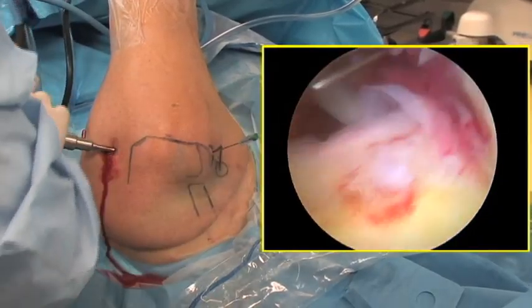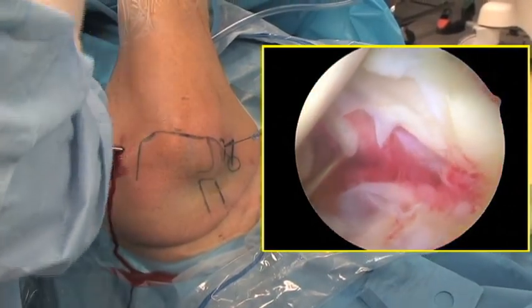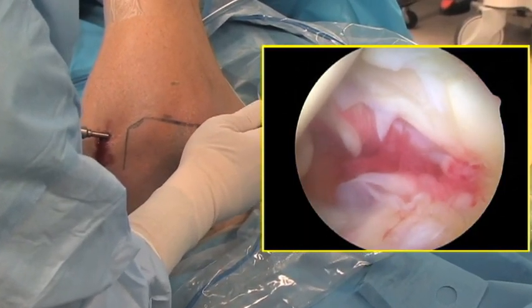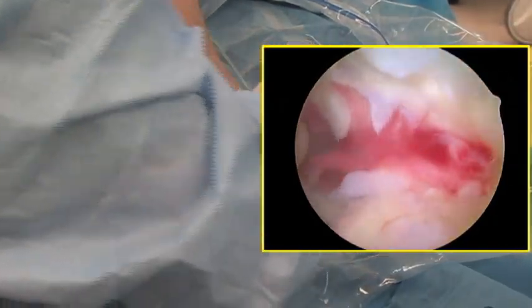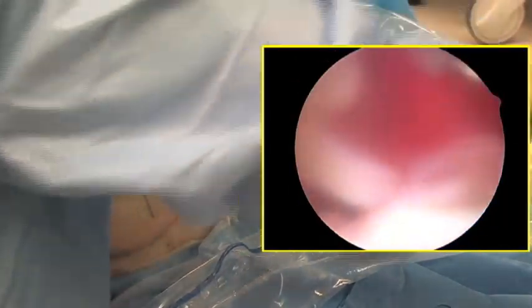The anterior portal is then established. A spinal needle is inserted first to estimate the location, and then an 11 blade is used to cut the skin. The anterior portal is halfway between the coracoid and the anterolateral border of the acromion. A blunt trocar is used to penetrate the joint.